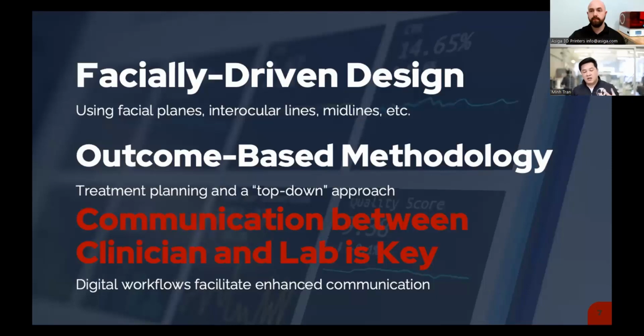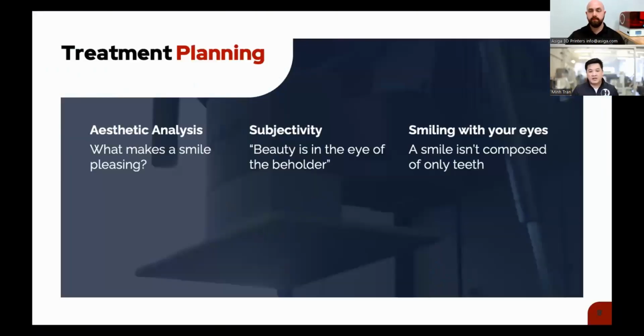and what the clinician has assessed. So focusing on the communication, we need to really rely on clinical examinations, the dental history, the patient medical history, and what the clinician has determined is a feasible treatment plan. And our job as technicians is to really just bring that vision to life. So when we talk about treatment planning and elaborating a little bit more, we're performing an aesthetic analysis, right? So typically the clinician will be doing this.